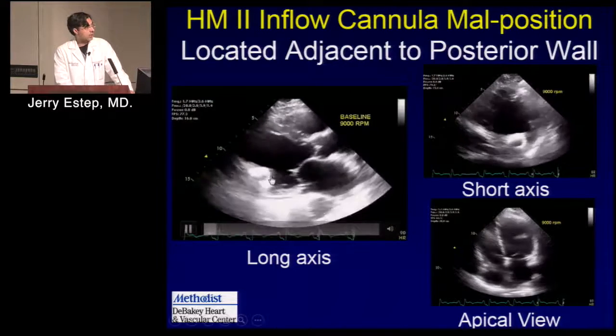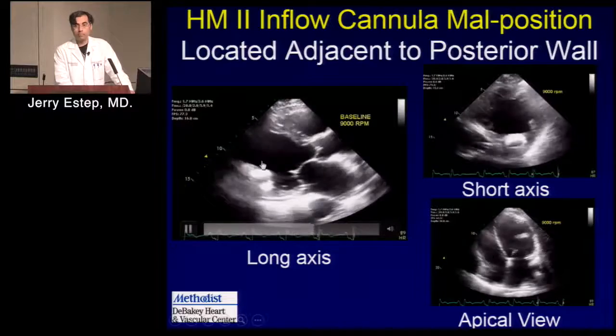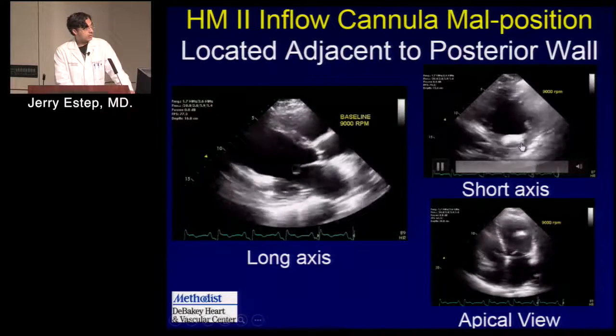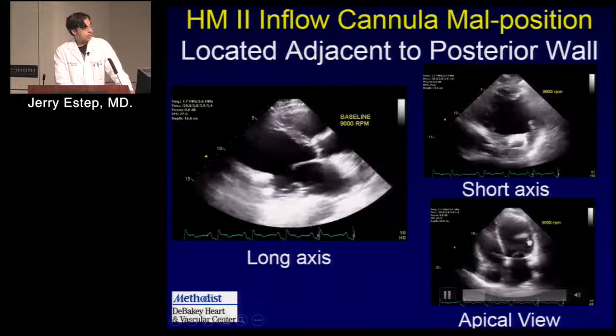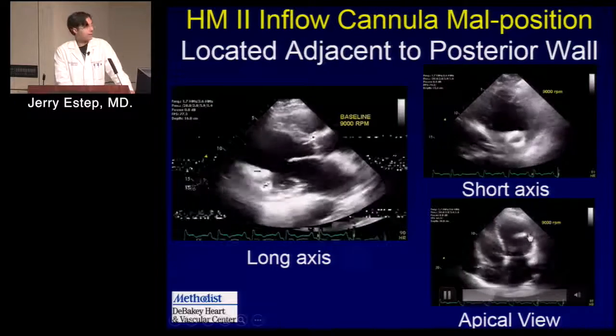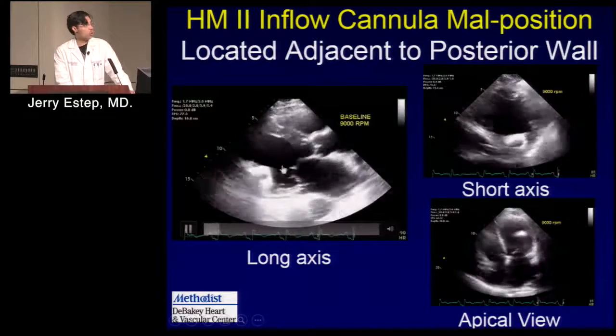So in contrast, this inflow cannula is very posterior. And when you look at this as exemplified by the short axis, and you look at the apical four, you see the metallic artifact mid-ventricle. So this is overtly malpositioned.